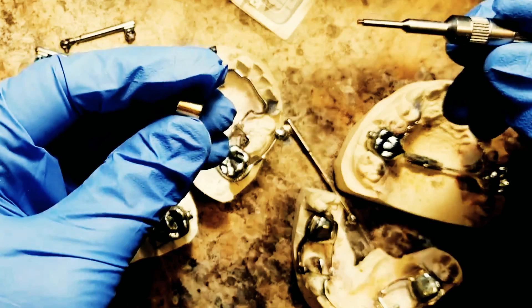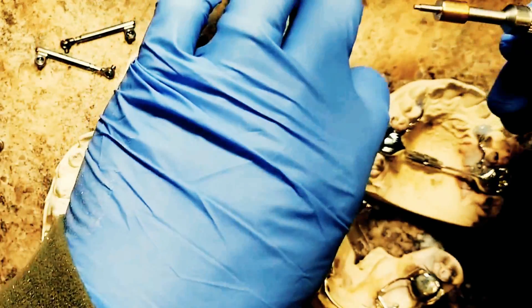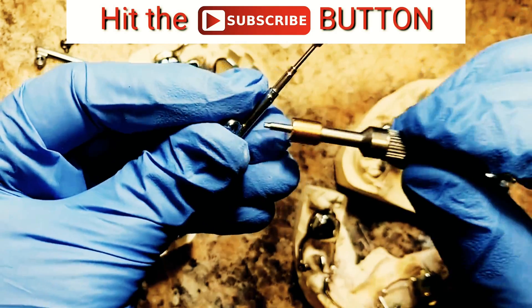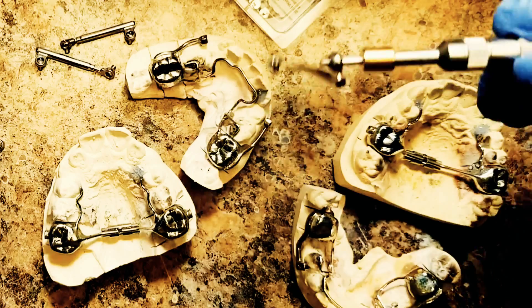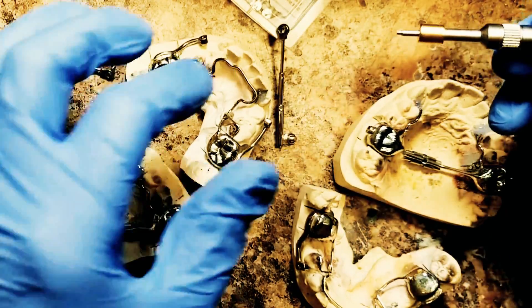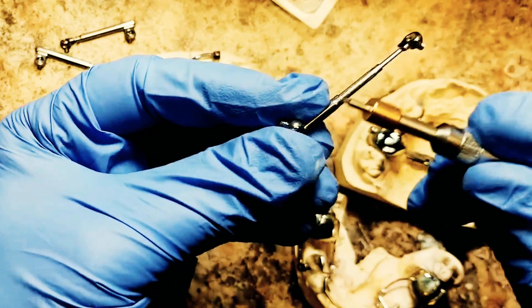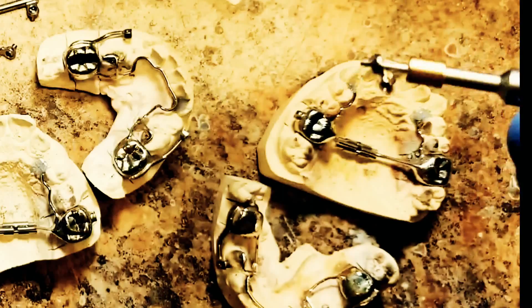Without the magnet, it'll fall off. But with this magnet, you can pick up the Hanks telescoping arms and it'll hold them in place, so you're not going to drop it as readily. If you do knock it off, it will eventually come off — it's not a permanent fix — but it definitely helps when you're assembling this.